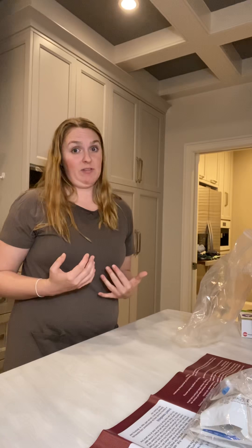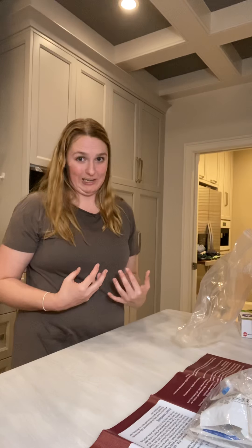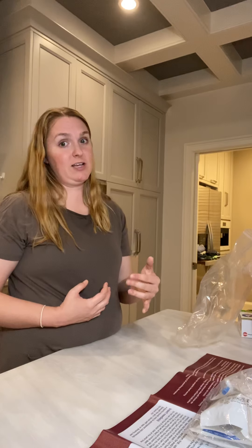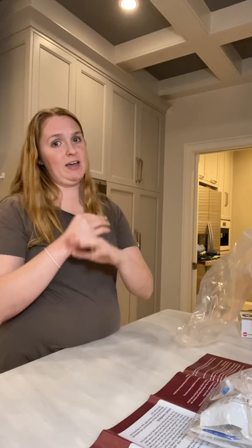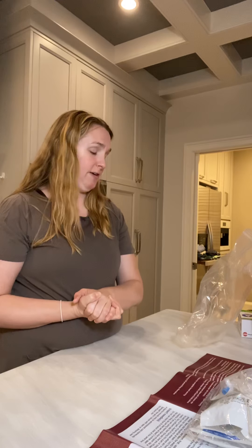I've already got my tape and scissors over next to the chair that I sit in to do infusions. You don't have to sit down — you can move around — but I find that my stomach gets a lot more sore if I move around, so it's easier if I just sit for the entire thing. I do it right before bed because you get really tired while you're doing it, and then I can just go crawl in bed when I'm finished. I've already taken my medicine for the night, brushed my teeth, washed my face — everything. So I'm ready to infuse.